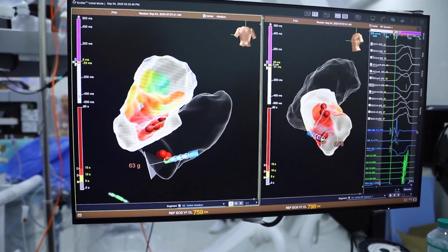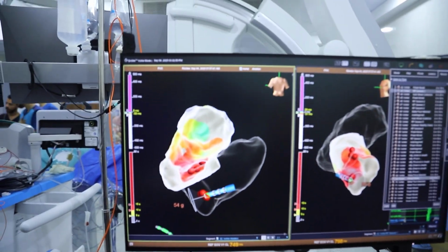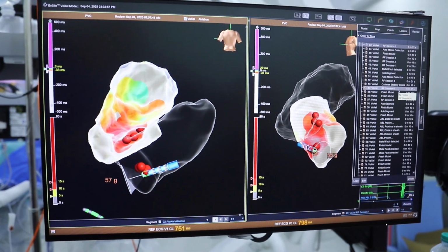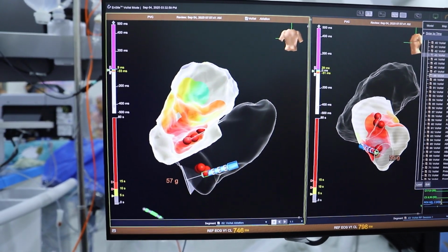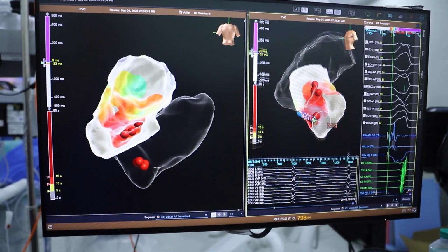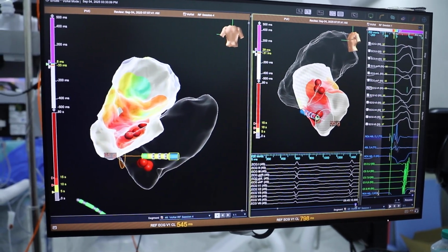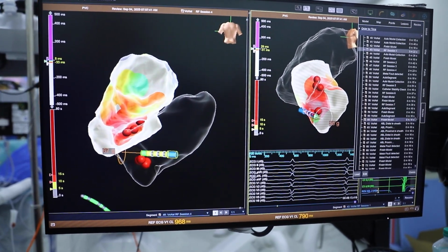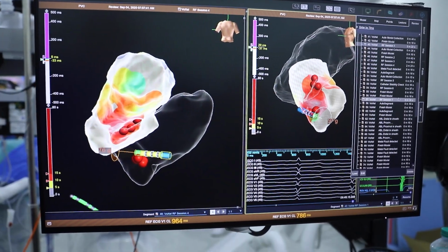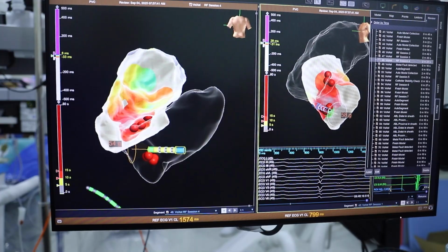Although the timing is not as perfect as from the right side, when we were ablating this point, it was only one single point ablation. You have to have an intelligent engineer like Wael to have successful ablation of PVCs. Also, we use the conventional machine to make sure that what he is seeing is what we are seeing, so we have double checking on that.